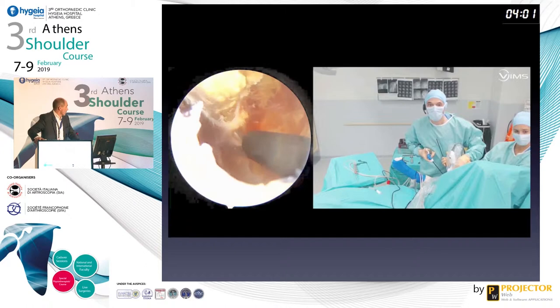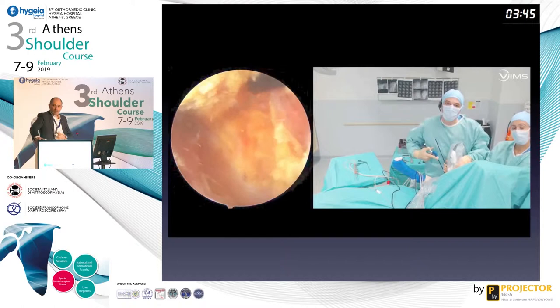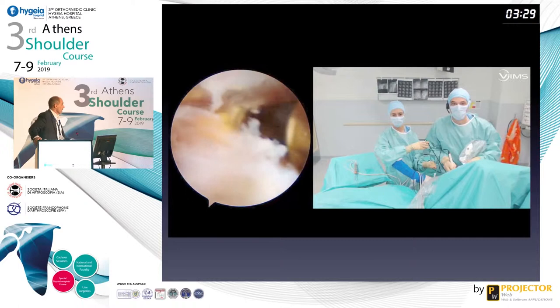Of course, at this point, there is no risk because the nerve is beyond. We are about 10 centimeters deep into the shoulder, into the axillary field, and there are no vessels there. If you are used to open surgery, you can feel this point with your scissors, your finger, and in fact it is very easy.